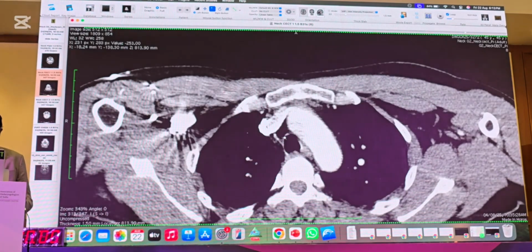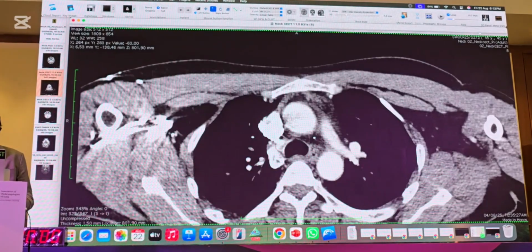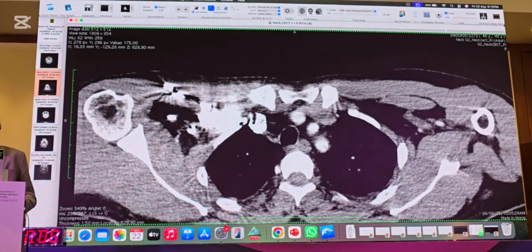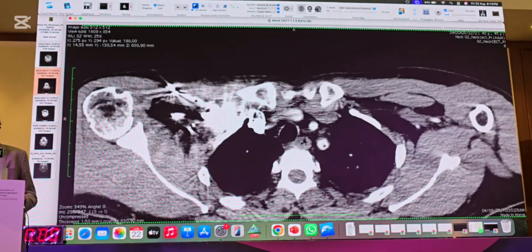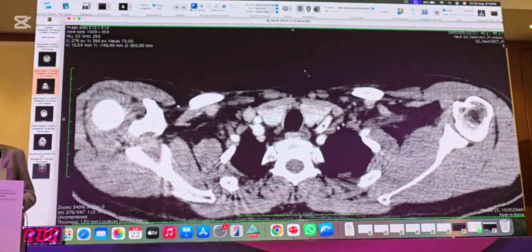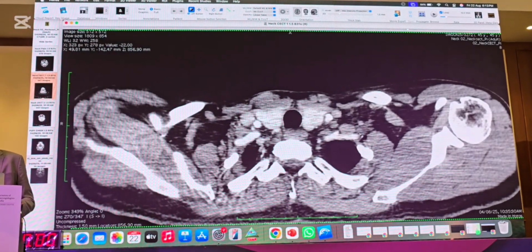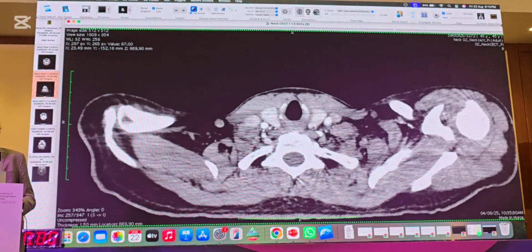Can you see the difference? So now it is still with contrast, that's the arch of aorta. Now three structures are clearly seen. What is this one? Left side. Subclavian. Left subclavian, just follow that. So this is left common carotid, left subclavian. That common carotid goes anterior and left subclavian goes this way. And this is common carotid, just follow that. That's left common carotid.